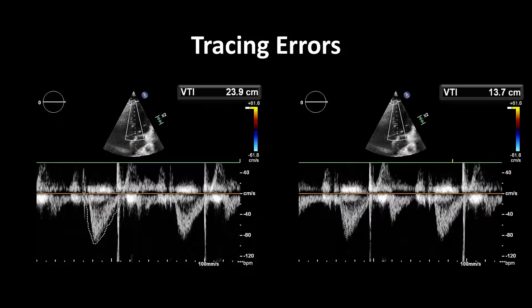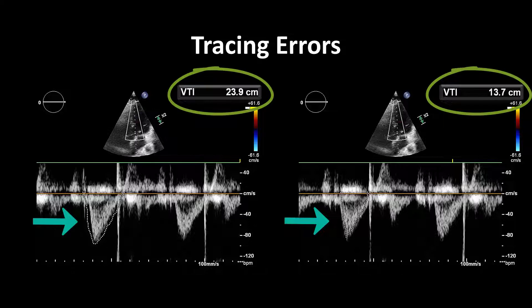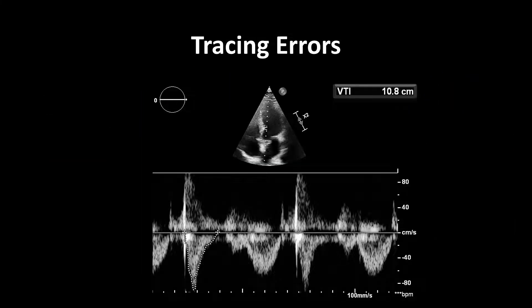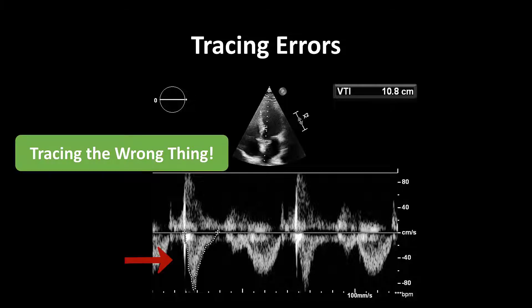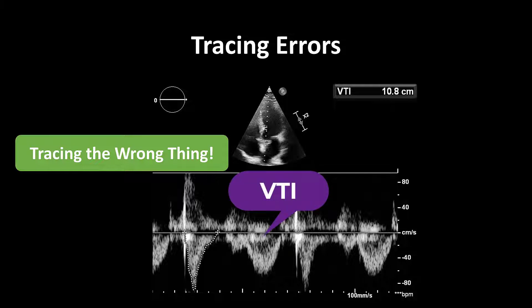Another common issue is tracing errors. Here's an example where the VTI is acquired really well, but on the left-hand side the VTI envelope has been over-traced and on the right-hand side it's been under-traced. The exact same VTI sample gives you such a different result depending on how you trace it, so take your time and trace it accurately. Also make sure you're tracing the correct flow — blood flow happening in diastole, identifiable by mitral inflow, should not be traced. You can use ECG leads to determine the phases of the cardiac cycle to ensure you're tracing the VTI envelope seen in systole.